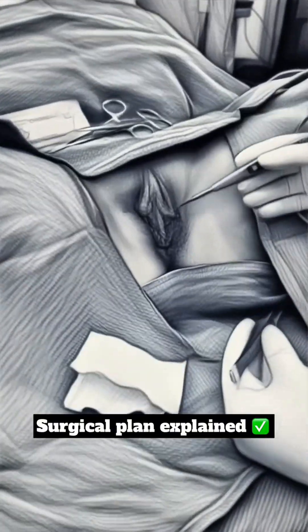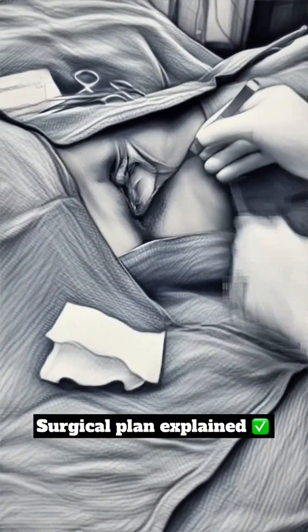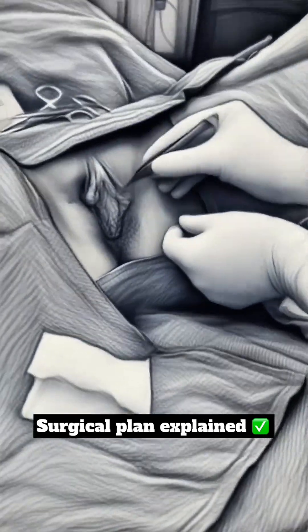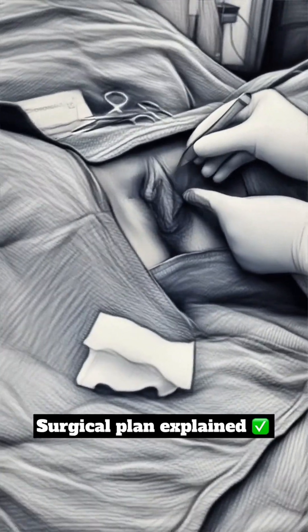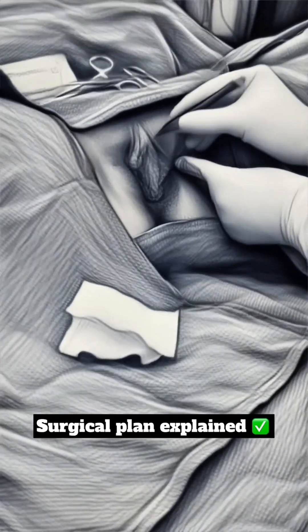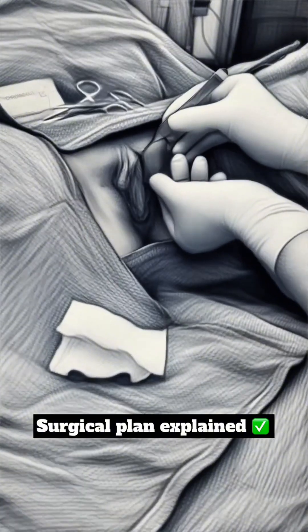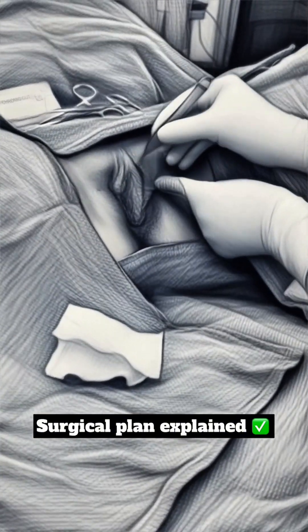I've done my markings before we came into the OR. If you take a look, her labia has this triangular shape and there's a fold that goes forward. Labiaplasty means removing the excess labia. Here we're doing what's called an anterior extension because the fold goes all the way to the front. The clitoral hood — the clitoris is underneath there — we won't be touching this, it's just on the sides. There's extra skin that goes full length, so I'm going to be trimming all of this.